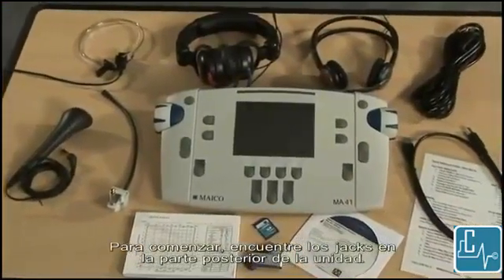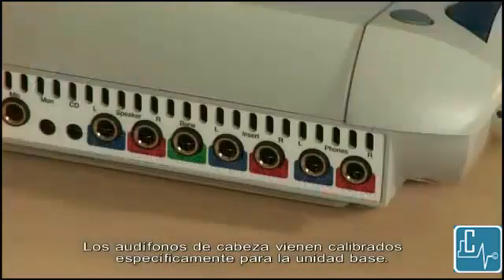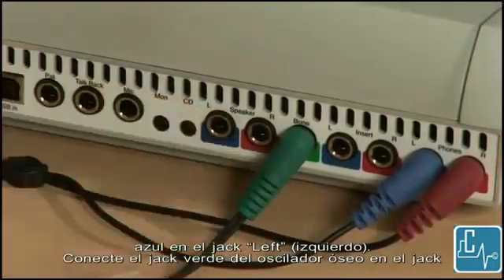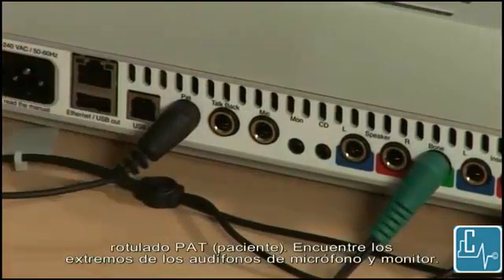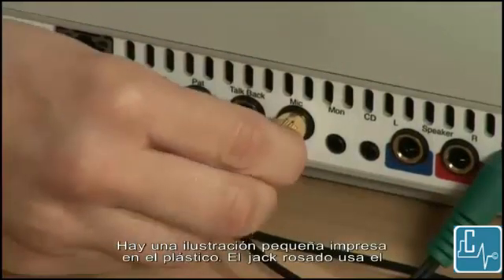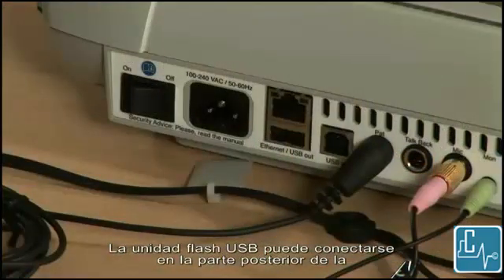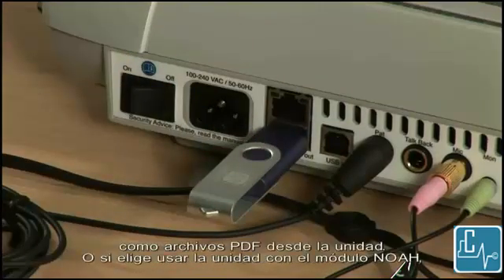To get started, locate the jacks on the back of the unit. The headphones come specifically calibrated to the base unit. Insert the red plug into the jack labeled right, and insert the blue plug into the left jack. Insert the green jack of the bone oscillator into the jack labeled bone. Insert the patient response into the jack labeled pat. Locate the ends of the mic monitor headset. There is a small picture imprinted in the plastic. The pink jack uses the included adapter and plugs into the mic outlet. The green jack plugs into the monitor jack. The USB flash drive may be plugged into the back of the unit in the USB out slot, and is used to save tests as PDF files from the unit.